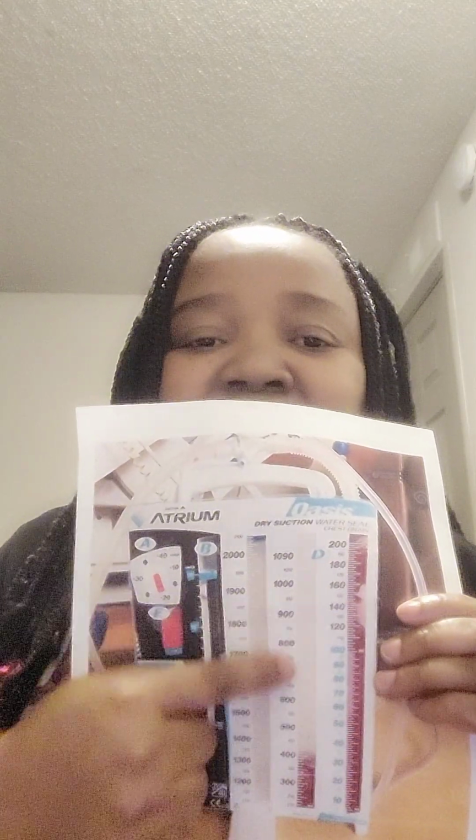The way you know that something is wrong is if you see that there is drainage here, and drainage here. That means it fell and the drainage spread across all the units. So originally it should be like this. If it fills this place, then it goes down here, fills this place, and then it fills this place. So that's how you know something is wrong.